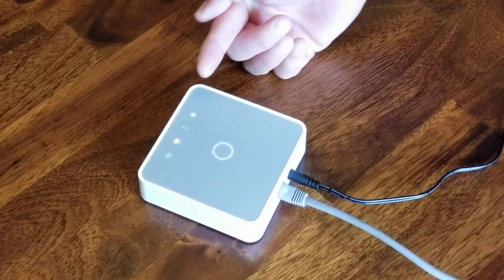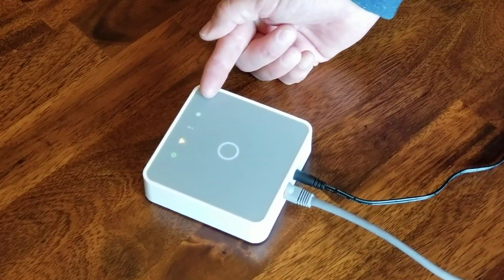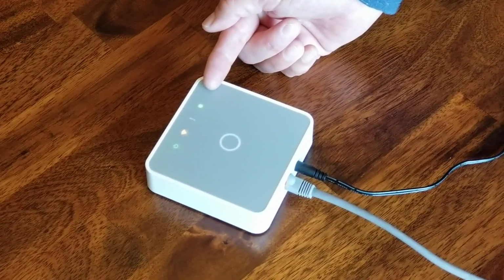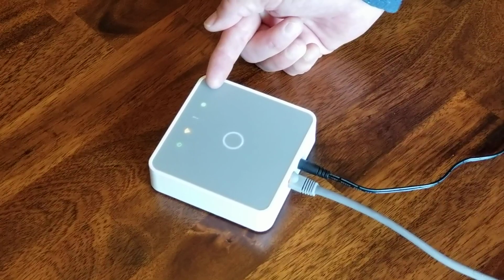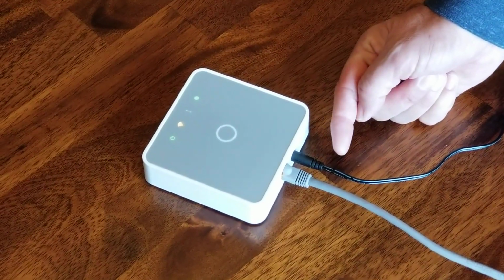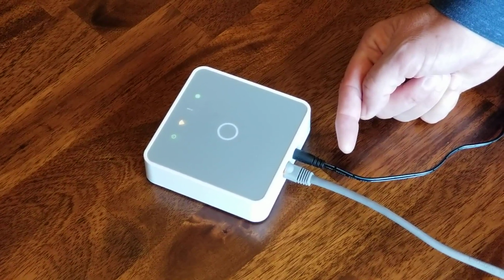At any such time that the connectivity light is not blinking and is off, this means that your wearable device is disconnected. To initiate a reboot, simply unplug the power cord and plug it back in, and within 7 to 8 minutes, the reboot will occur and you will be reconnected.